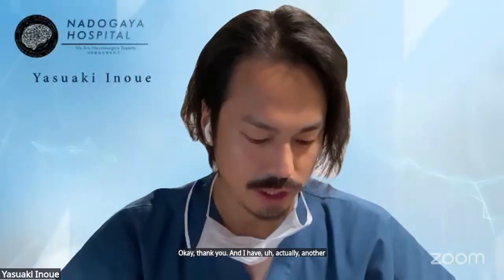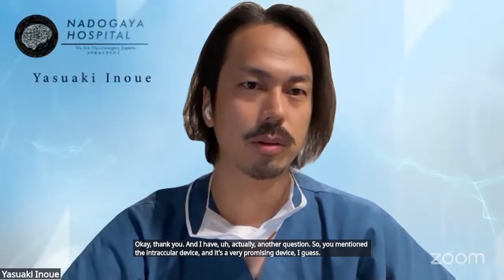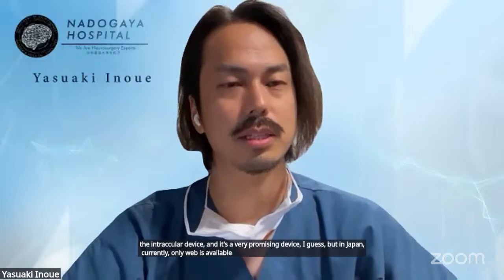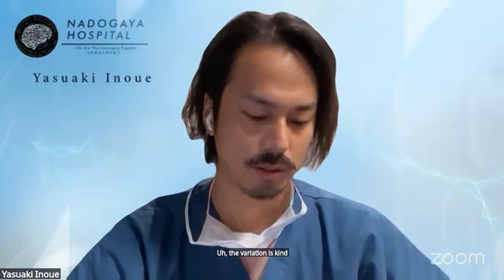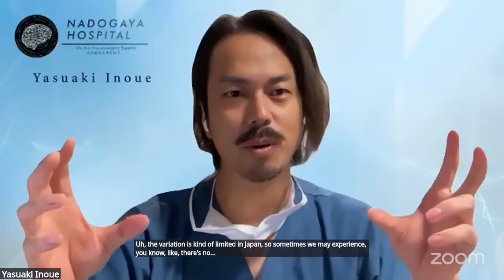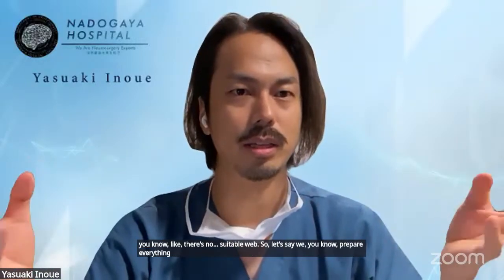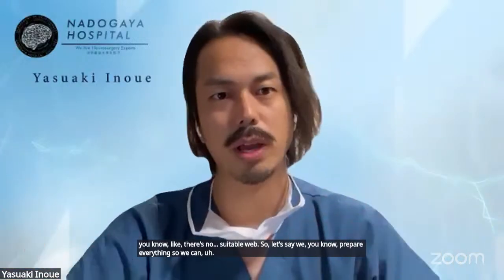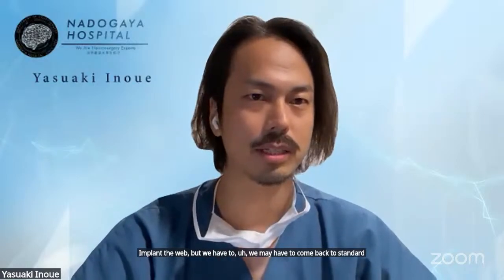Okay, thank you. And I have another question. You mentioned the intrasaccular device, and it's a very promising device, I guess. But in Japan, currently only WEB is available, and since size variation is limited in Japan, sometimes we may experience there's no suitable WEB. So let's say we prepare everything so we can implant the WEB, but we may have to come back to stent-assisted coiling or something. Are there any cases you have experienced like that?